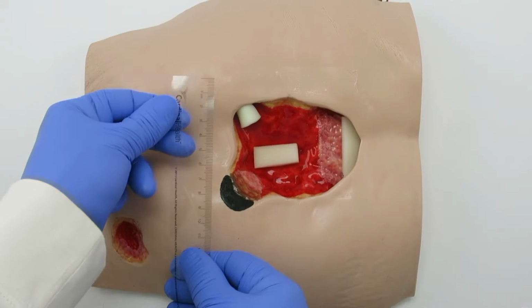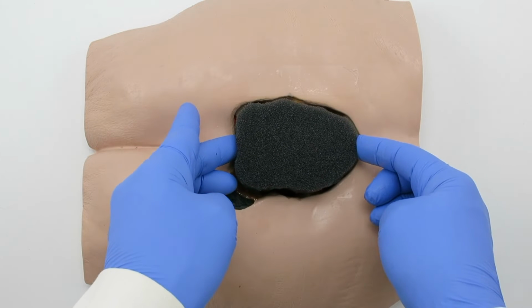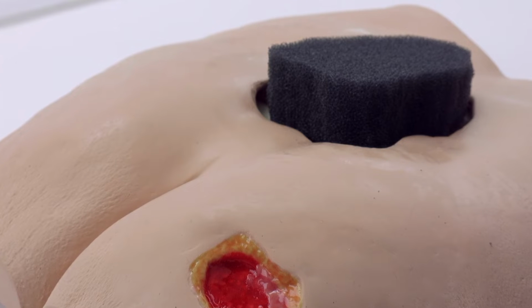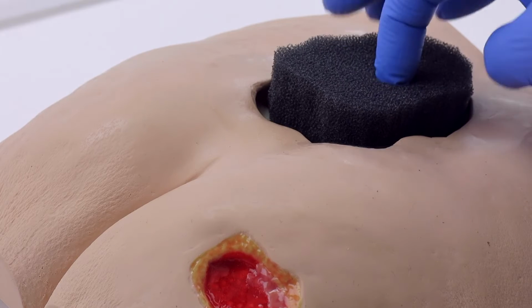Next, fill the wound bed with black foam. Trim to the shape of the wound. It should fill the wound, lightly touching wound edges, but not touching or covering the peri-wound skin. If it is sized incorrectly and covers the peri-wound area, there is a risk of causing skin maceration or skin injury. Black foam may be stacked in deep wounds.